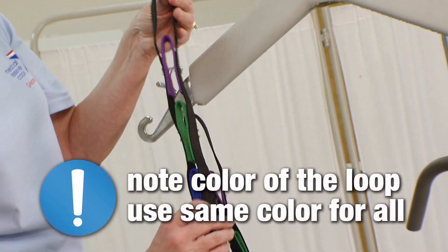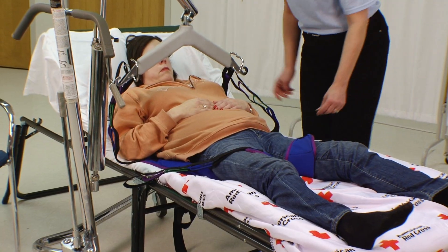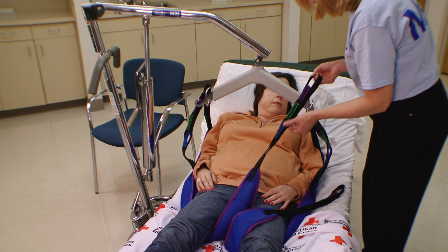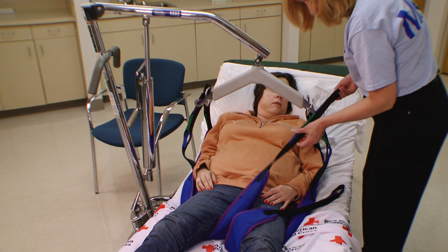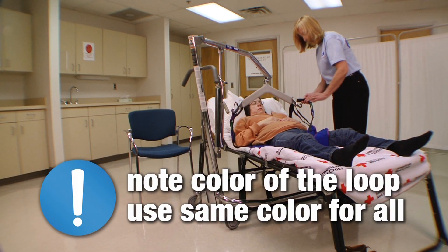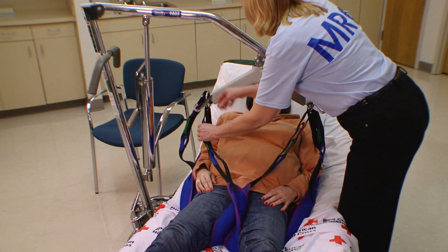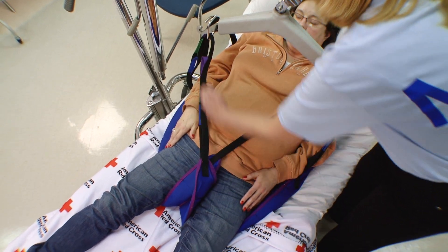Note the color of the loops and use the same color loops for all straps. Take the tail that is under the right leg, bring it up and across the person's body, and hook the loop to the cradle on the left side. There are four loops on the tail color coded black, purple, green, and blue — make a note of which color you are using. Take the tail from the left leg and cross it over and hook the loop to the right side of the cradle. Use the same color loop as you did for the right leg. This will give you a finished look of an X.